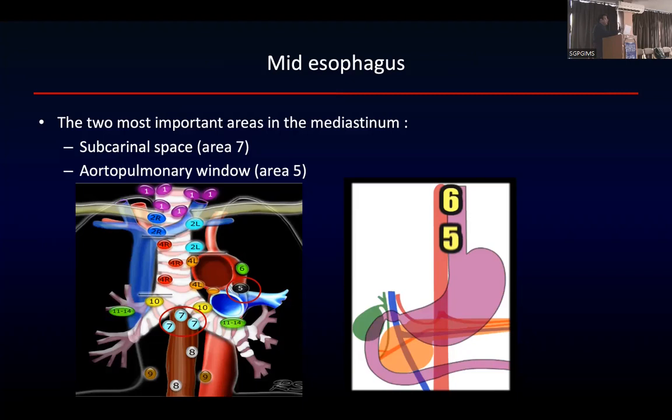the mediastinum. Obviously this may be different. You can even say that you are examining the mediastinum. No one will ask you which station it is. It doesn't matter, this is just for the sake of learning. Station 1, 2, 3, 4, 5 and 6 are stations of linear imaging of the whole abdominal area.